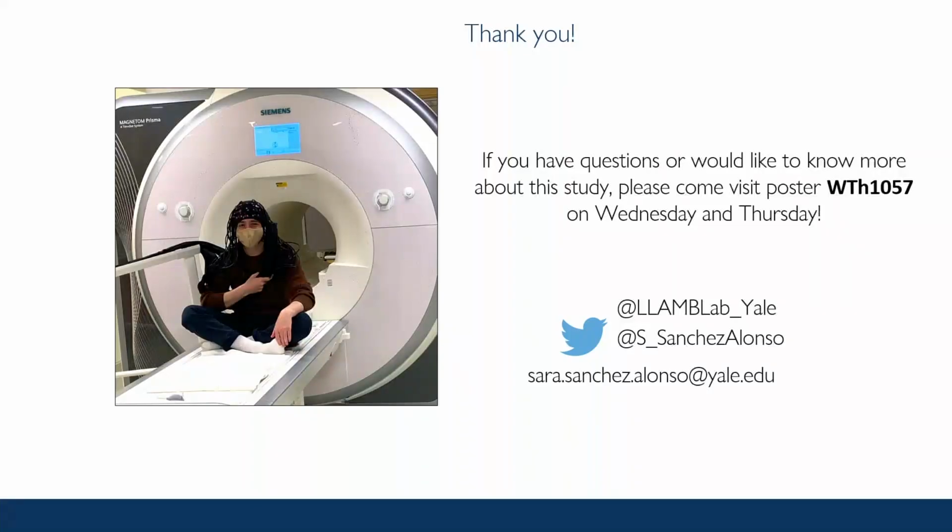Well, I can just start with a question related to somebody's comment in the app. With fMRI, you can get signal from the LGN, a very deep area, but functional NIRS can only get signal from more superficial brain areas. So if you're registering these two data sets, how do you account for these differences? Maybe for some deep areas you couldn't reach the signal. How do you compare these two signals, which have very different sensitivity for deep areas?